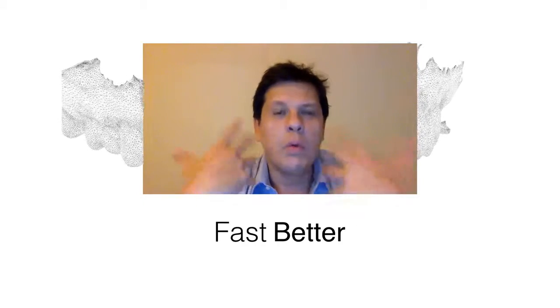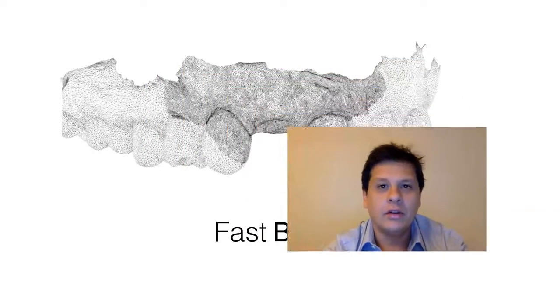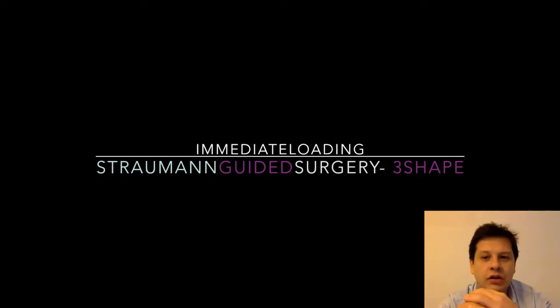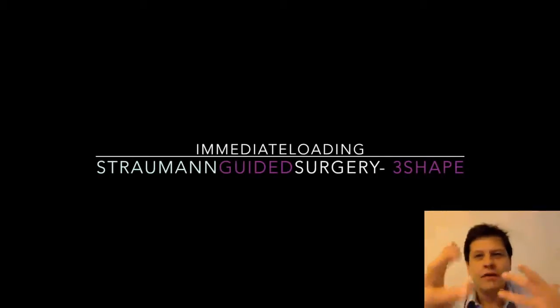So we want to be fast and we want to be better. So the first case that we're going to try and show you here, of course, that I use here brand and an intraoral scanner. Of course, it will change from brands and intraoral scanners, but the main idea is to show how this flow interacts in my daily practice.